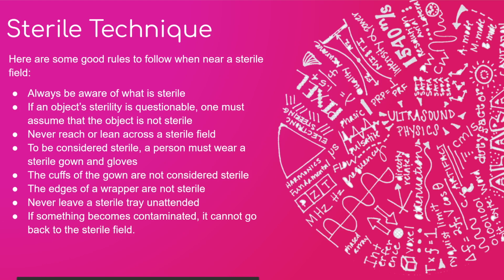Lastly, two last thoughts that I have on it too: never reach across the sterile field. If the doctor wants you to hand something to them, don't reach across, reach around it, move around it if you can. If you touch anything on that sterile field, it needs to be removed immediately. Another thing too, if you think anything is unsterile or contaminated on that field, get rid of it and let people know. If you drop something on the ground, don't just kind of look the other way, pick it up and put it back. No, that's not okay. You gotta get rid of it, get a new set of gloves out, get a new needle out, replace the part that has become contaminated.